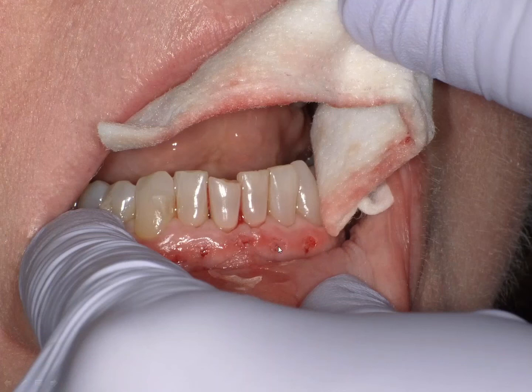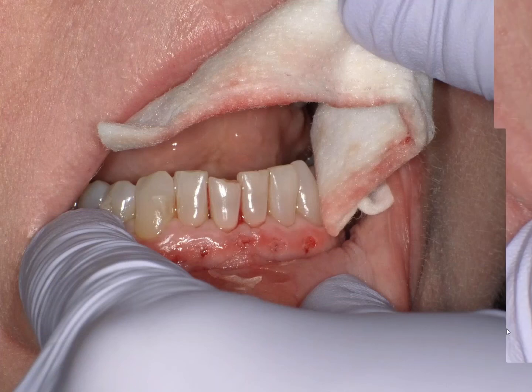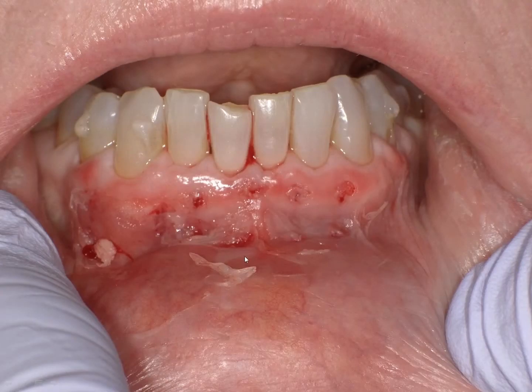Here's the perforations. One of the reasons I wanted to show this is what you see the next one here. This is sloughing that occurs from leaving that topical on too long. That's a Profound topical there, and that tissue sloughed off. It was totally my fault. We had the timer set at 10 minutes, and I left the Profound gel on for 10 minutes instead of just 4 minutes. She was fine. You'll see that this mucosal layer will replace itself in 2 days, and she'll be back to normal. But I wanted to get an idea of what happens if you leave that topical on too long.